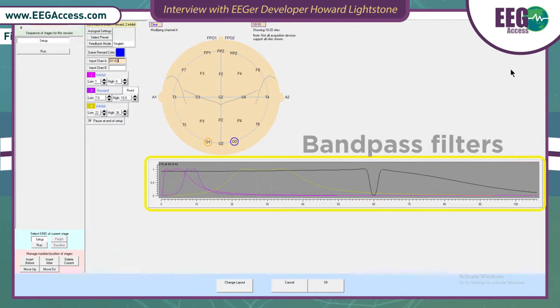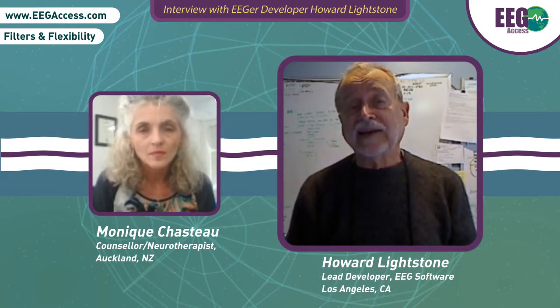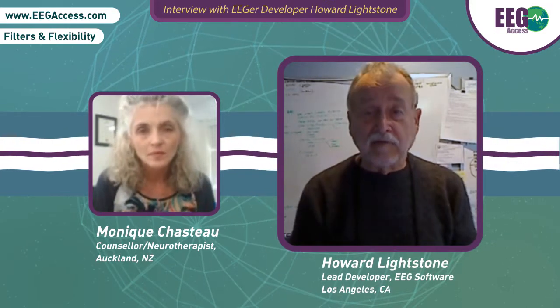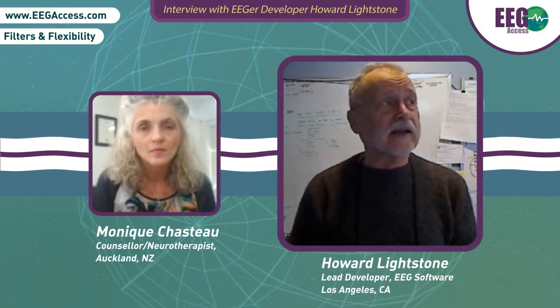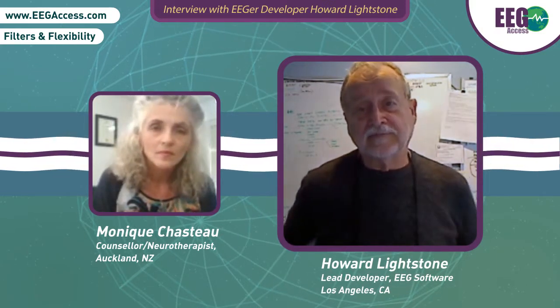It can be very narrow or it can be wide. You can switch to different filter models and see how narrow they get. It gets harder and harder, I believe, for the brain to track in on that. Eventually the brain will do it. You're just working harder.